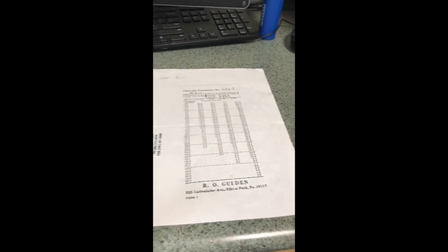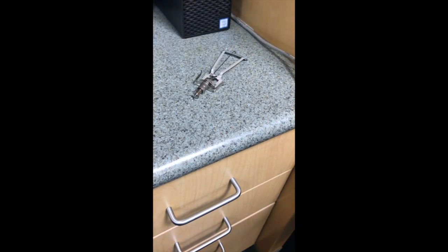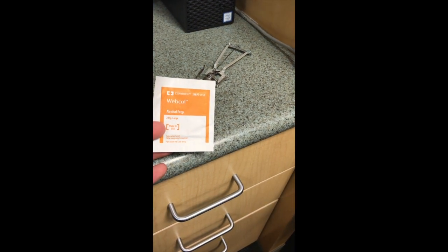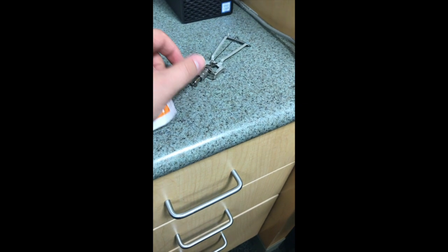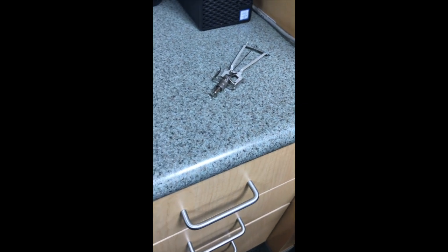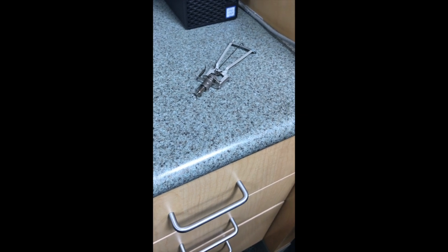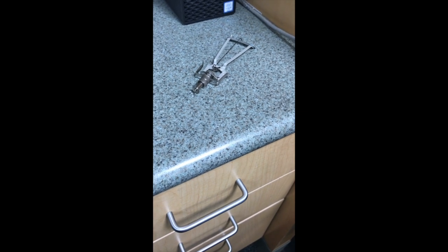After we're done with the tonometer itself and we've gotten our reading, we're just going to clean it with an alcohol wipe. You just wipe down the parts that touch the patient, and you can wipe down the rest of it as well. Avoid using the purple wipes on this because it does touch a mucous membrane.